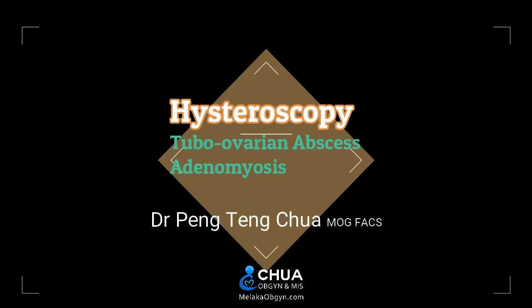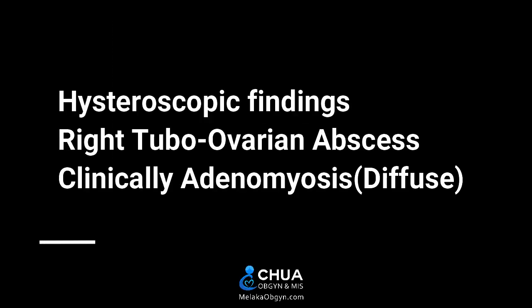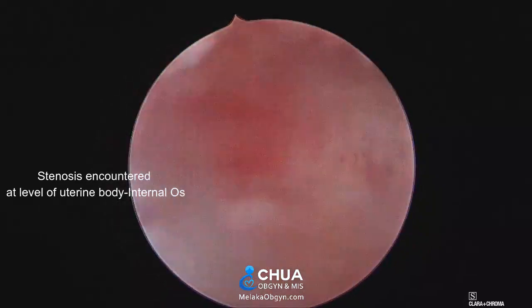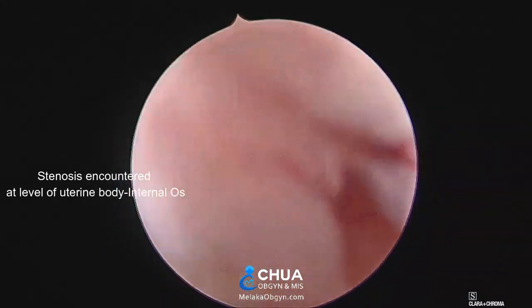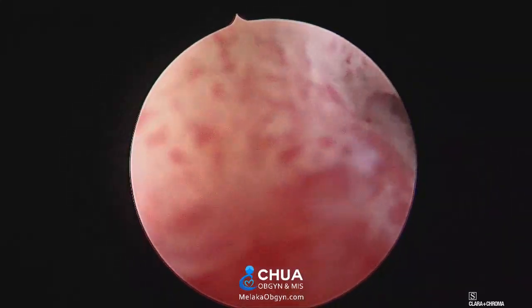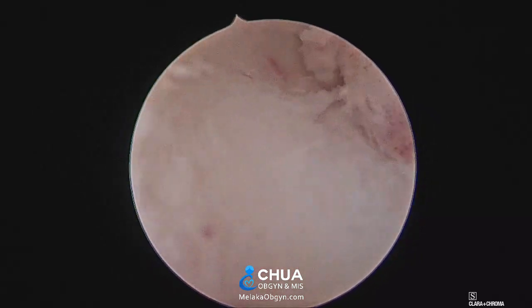This is Dr. Chua presenting a hysteroscopy finding for tubal ovarian abscess and adenomyosis. In a typical hysteroscopic examination, you can first see the cervical canal — especially the endocervical canal and the junction between the uterine body and the uterine cervix — which is actually stenosed.